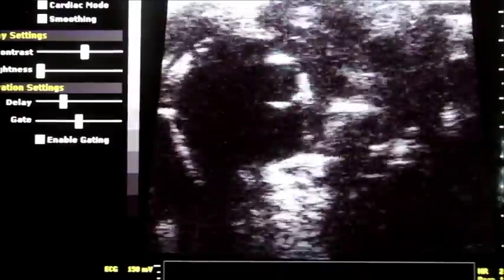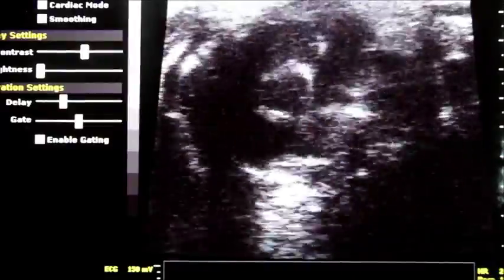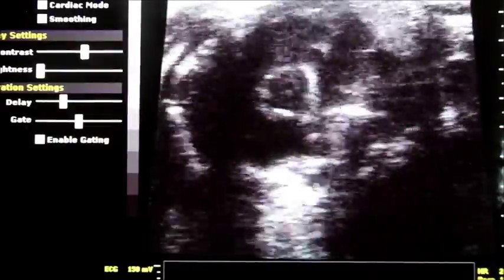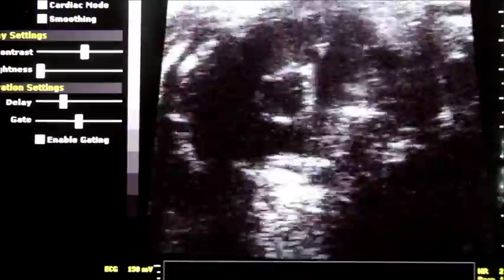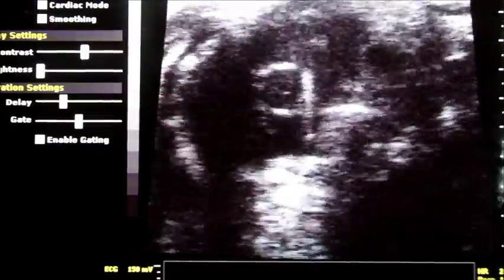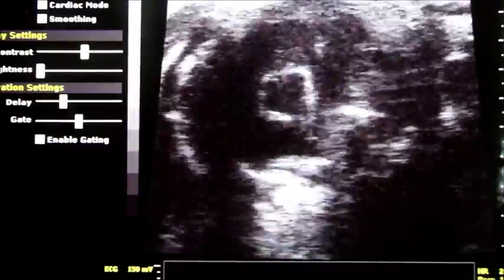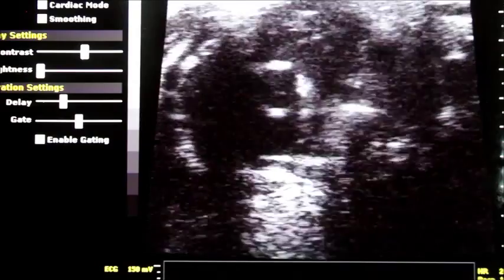The view should be focused on the pulmonary artery, where the bifurcation can be visualized longest. A movie clip is recorded for analysis. The probe should be slightly adjusted in the short axis dimension to obtain this view.